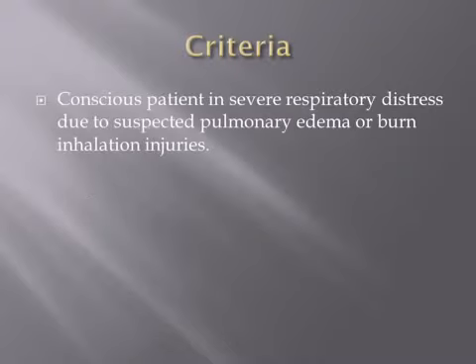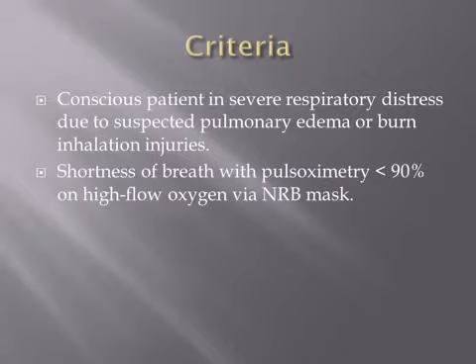Criteria. Patient must be conscious and in severe respiratory distress due to a suspected pulmonary edema or burn inhalation injury. Patient must have shortness of breath with a pulse ox less than 90% while they are on high flow oxygen via non-rebreather mask.